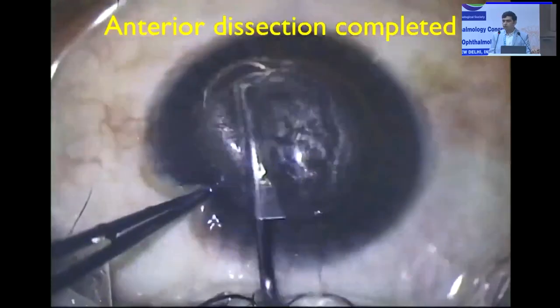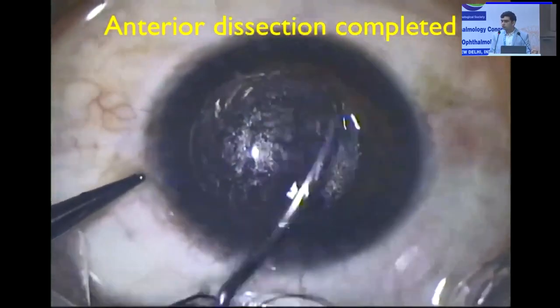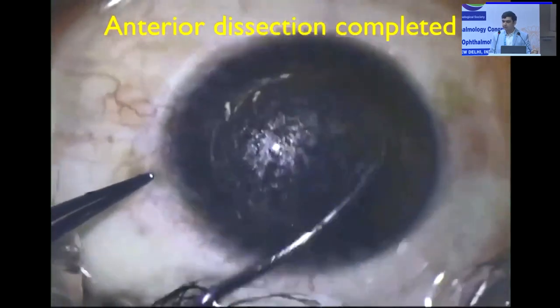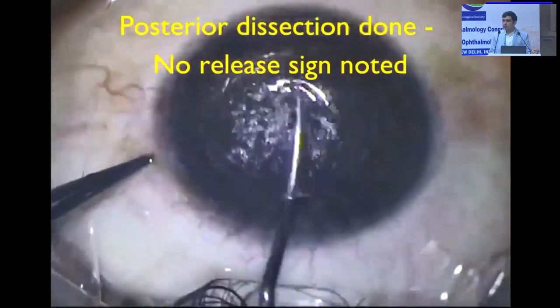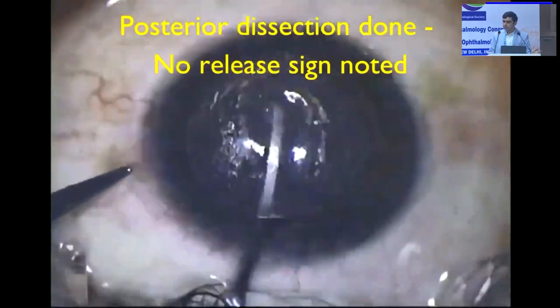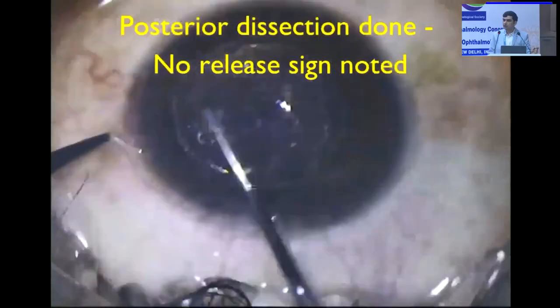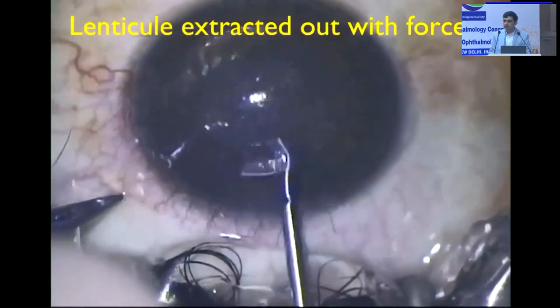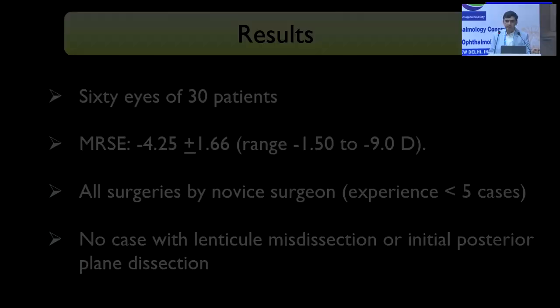So right here you see the sudden release of the resistance that you feel because you have already delineated that part before. Then the rest of the surgery is proceeded and completed in the usual manner by further completing the anterior dissection and the posterior dissection and taking out the lenticule. But when we do the posterior dissection, because you have only single area of posterior delineation that you had done, you will not notice any release sign here. So this ensures all the correct planes identification at multiple checkpoints.